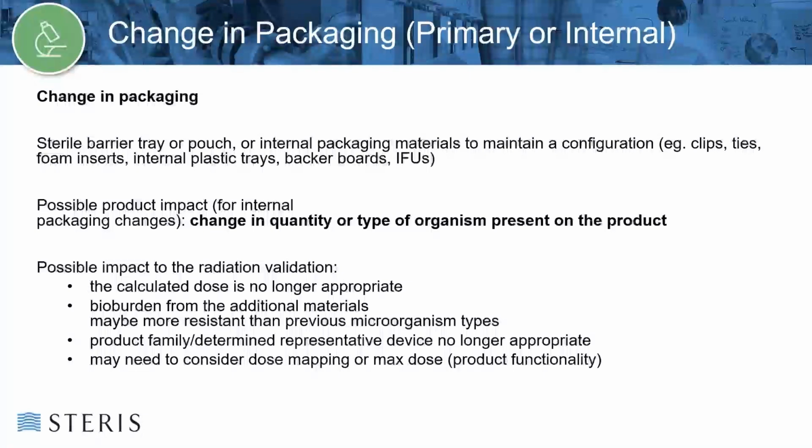It could result in a change in bioburden types, which could be more resistant than previous organism types. It could also require an assessment of the product family and any representative devices. Additionally, it may require a need to consider dose mapping or max dose product functionality testing.